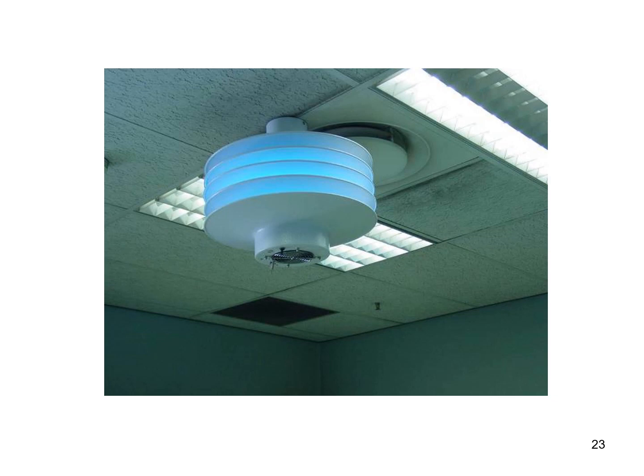This is a picture of an upper room UVGI next to an exhaust fan. If the air flows too fast, then there is not enough time for the UVGI to irradiate it. So this is not proper fixation.